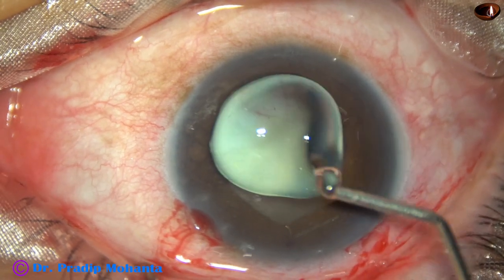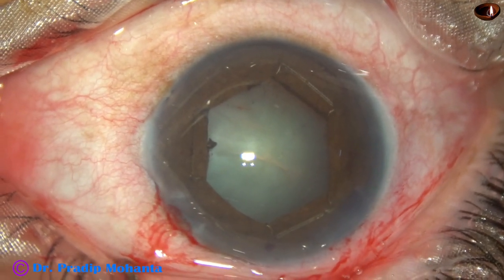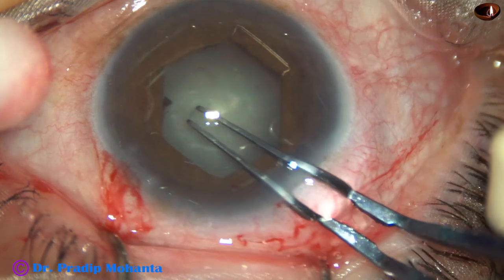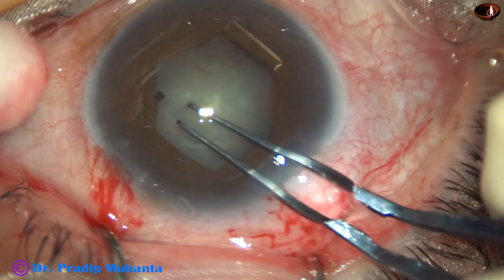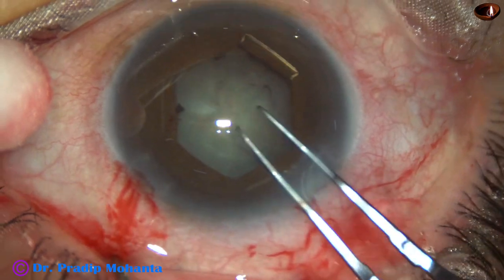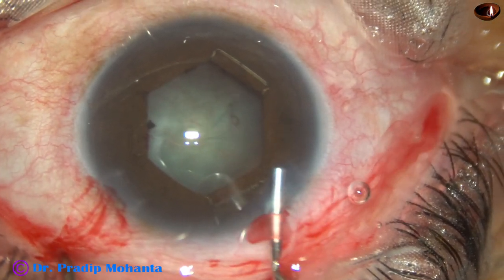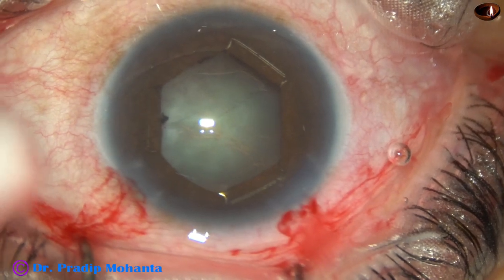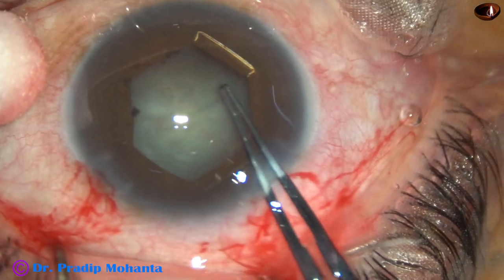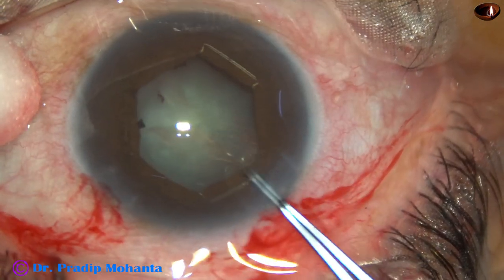The size of this pupil is about 5.5 millimeter and we can manage the case nicely now. Some visco has been injected in the anterior chamber as well as over the corneal epithelium. Now I'm doing rhexis with the help of utrata forceps. The staining of the anterior capsule is not good but still we can make out the anterior capsule nicely, and the rhexis is complete.